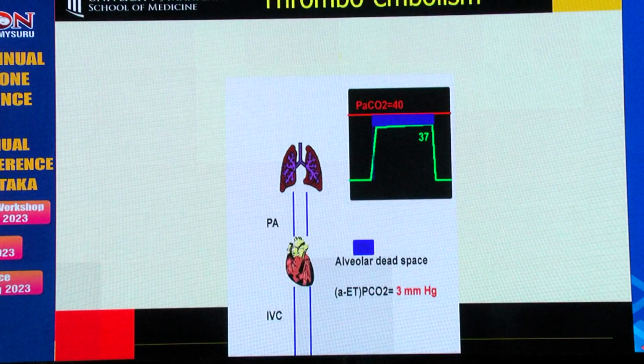And this is about thromboembolism. In fact, this is a very interesting case. I gave a lecture to our CA1 class, and the next day the CA1 resident was doing a hip surgery in a 70-year-old or 75-year-old gentleman. They positioned the patient, and the end-tidal CO2 dramatically fell. Initially, they thought it was induction. They gave a little bit of drugs. Then a thought went to the resident's mind, maybe it could be a pulmonary embolism.